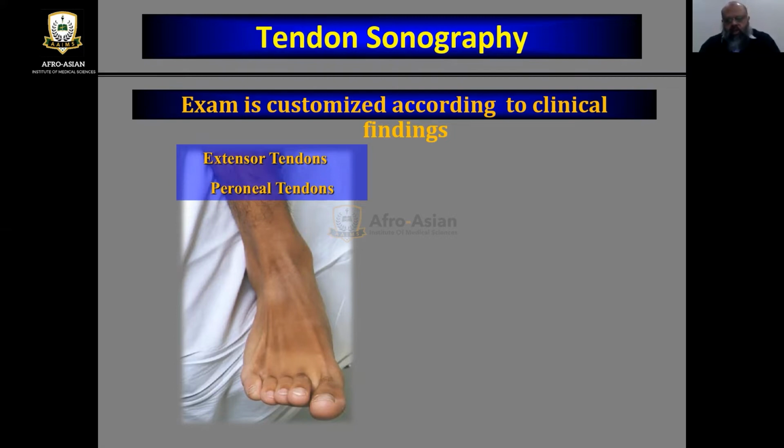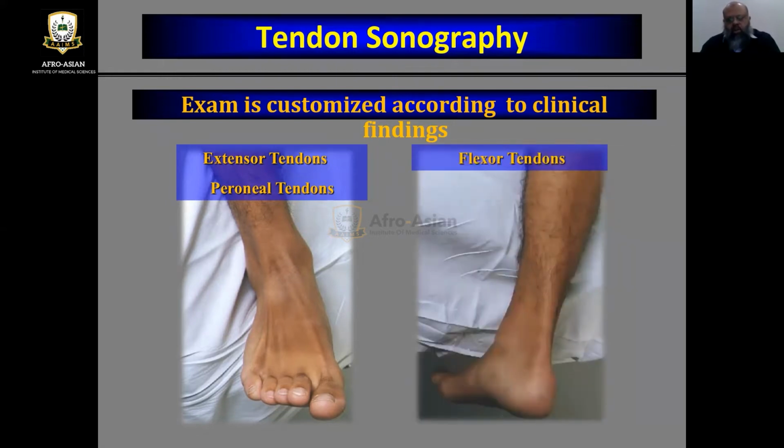Examination is customized according to clinical findings, like extensor tendons, we have peroneal tendons, then we have the back, which is the flexor tendons.